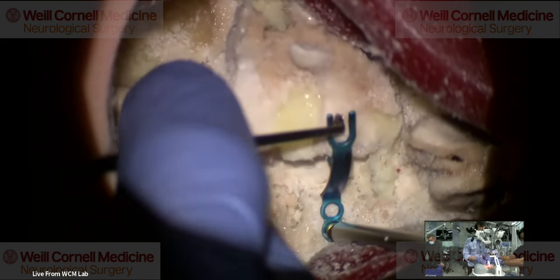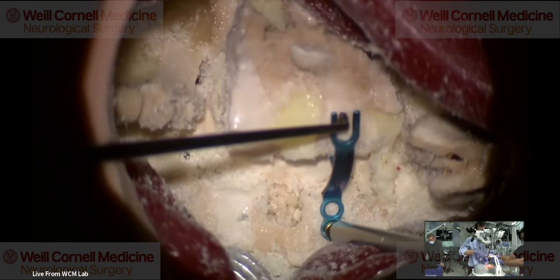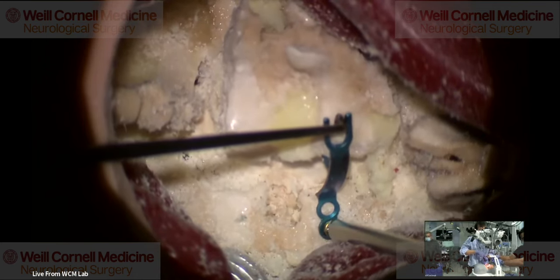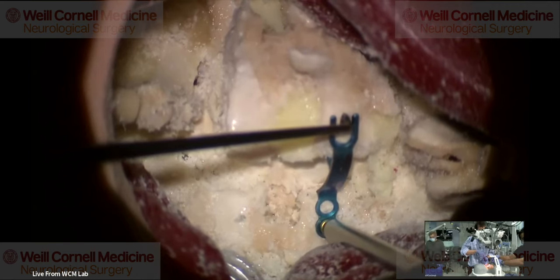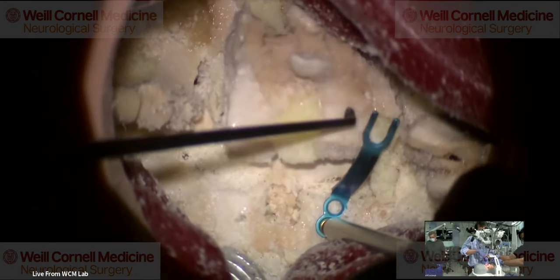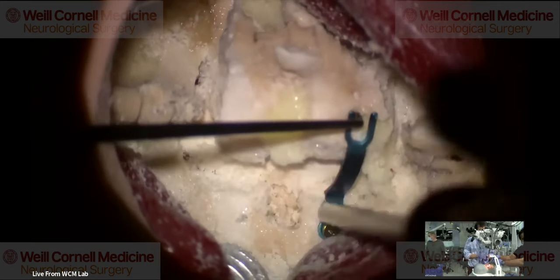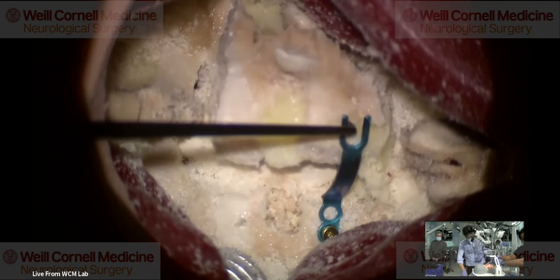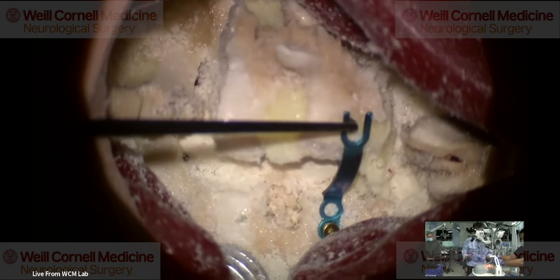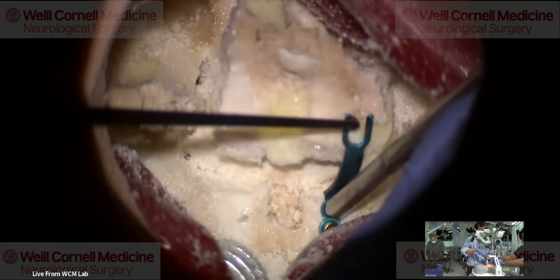So Ibrahim's doing this without looking at the microscope. He's doing it by looking at the screen, which is pretty difficult. It's like doing an exo. What is that called? Exo video that you guys were showing yesterday? Exoscope. So you would have made a great orthopod because you can do that, you could do it like it was a whatchamacallit, arthroscopy.